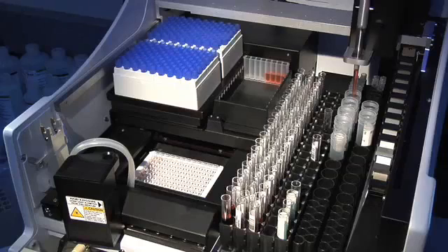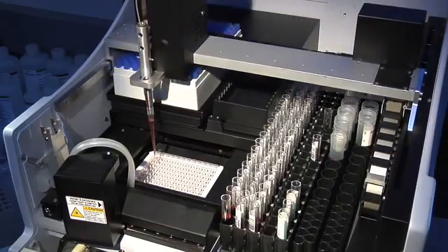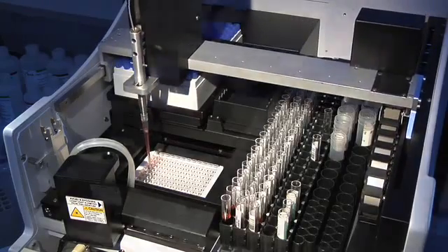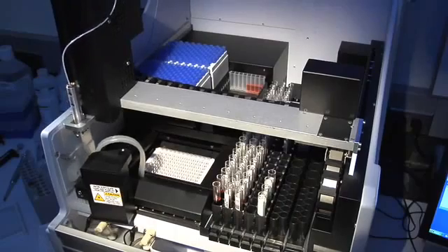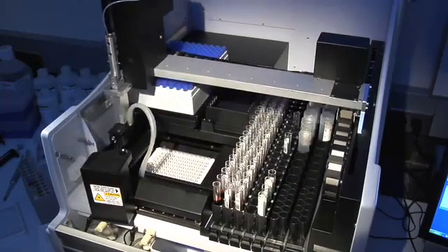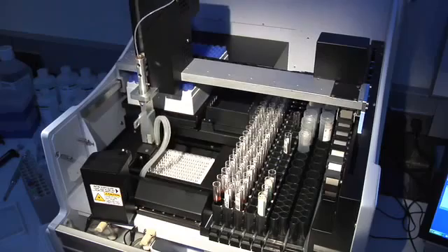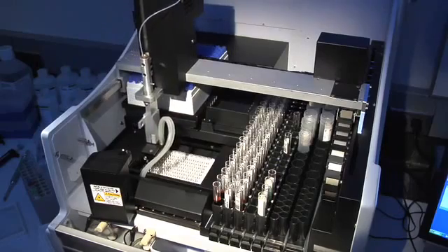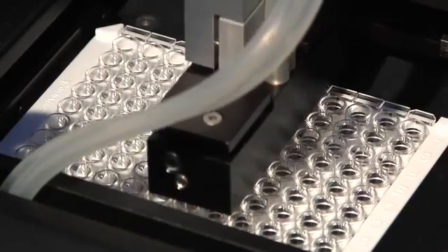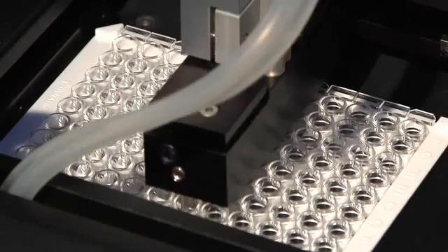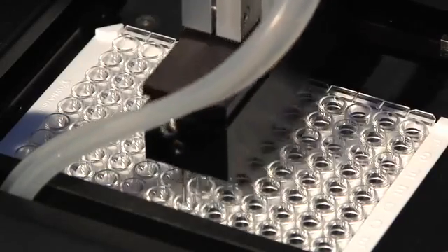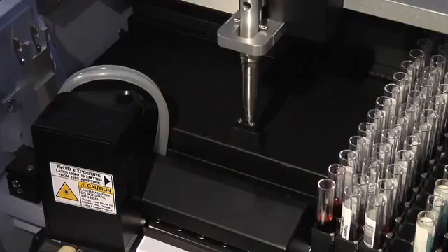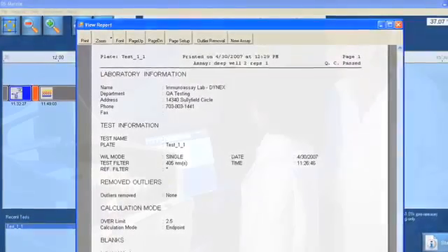Pipetting, dispensing, washing, incubating and reading, and data reduction.